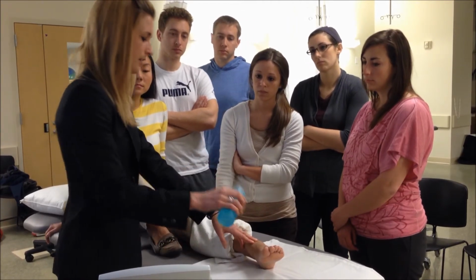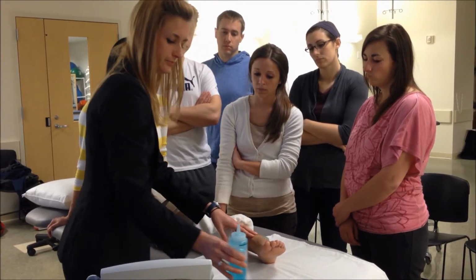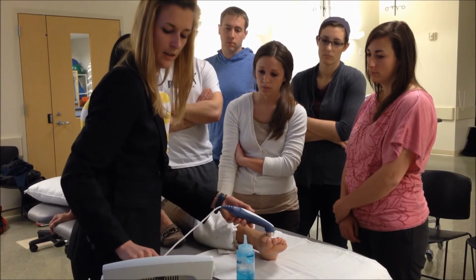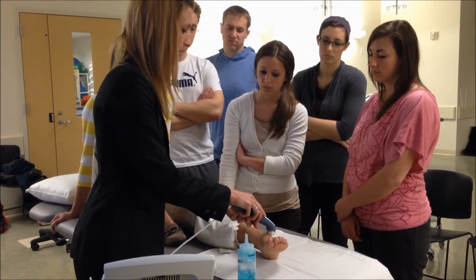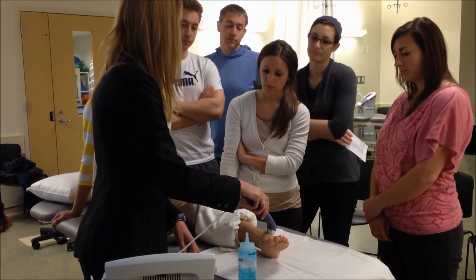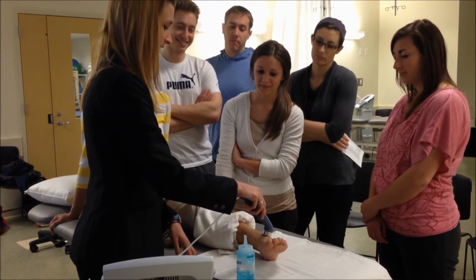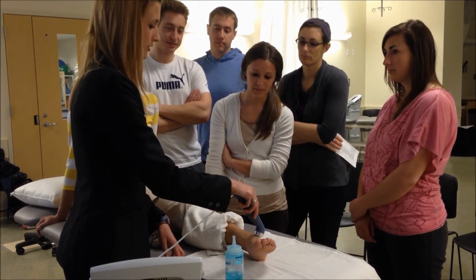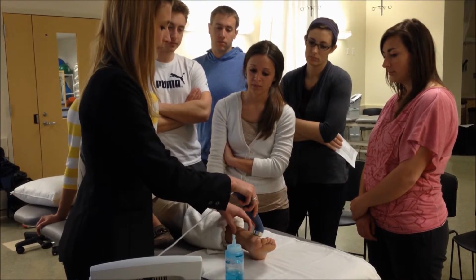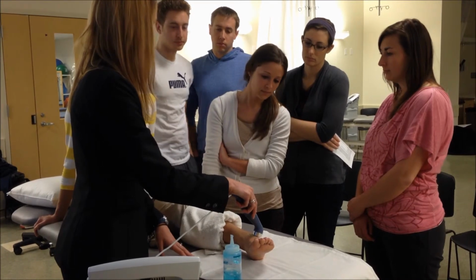Now we're going to apply the gel to the area. A decent amount, but not too much. And then I'm going to place the ultrasound head on the area and press start. So, small little circles. Does anyone remember how many times the size of the ultrasound head? 1.5 to 2. Exactly. In very small circles. Okay, keep it moving. We're kind of close to a bone here at the lateral malleolus. We want to steer clear of that and make sure we're just getting on that ligament.